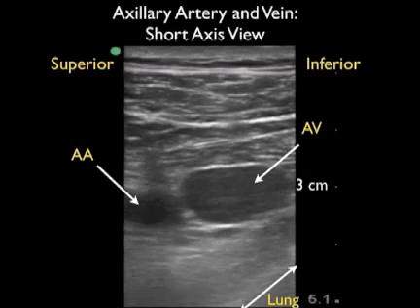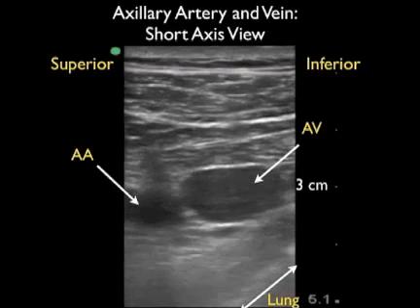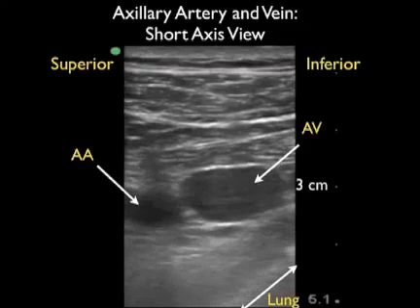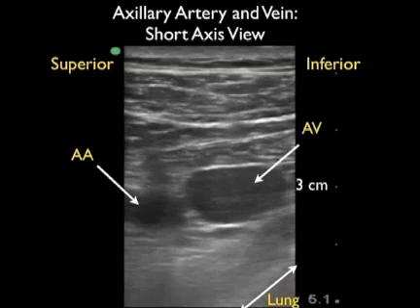Notice towards the back of the image we can actually see the lung sliding up and down as the patient breathes at about the 5 centimeter mark. Thus it's very important to cannulate the vessel carefully and not to pass the needle deep past the axillary vein or artery to cause an inadvertent pneumothorax.